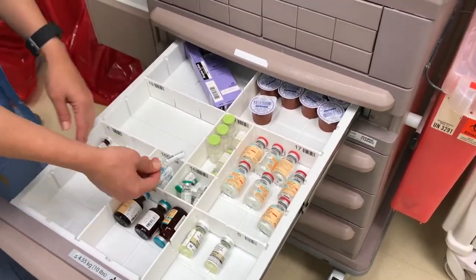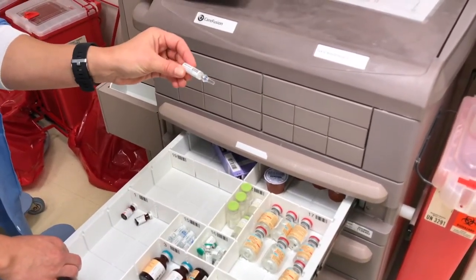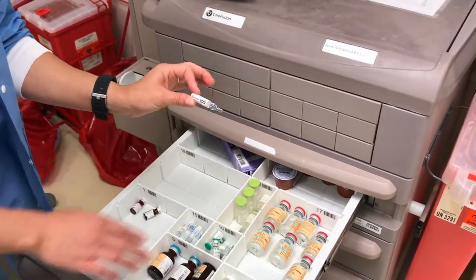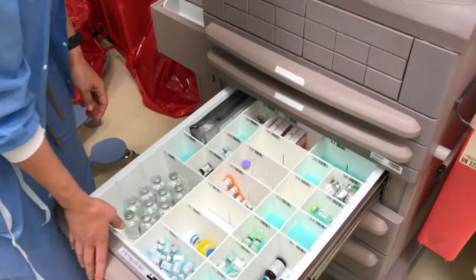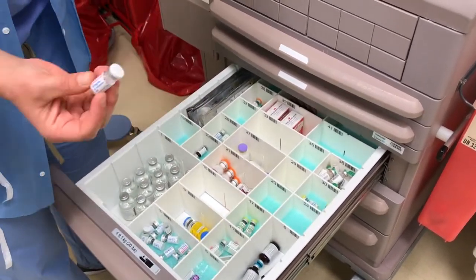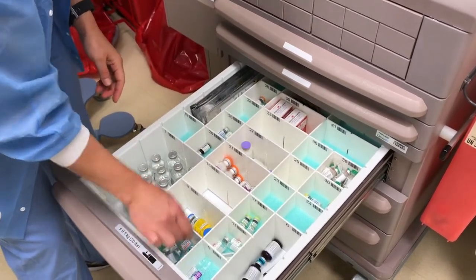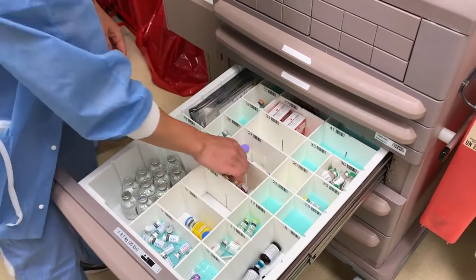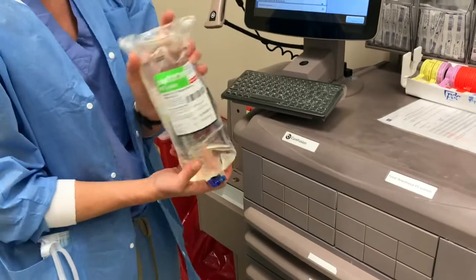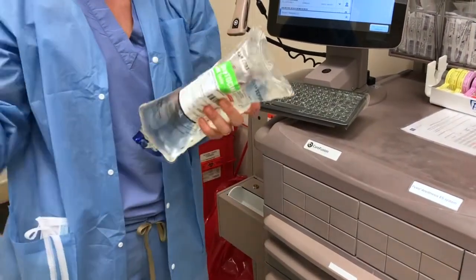And then here's our current spinal dose of bupivacaine, the 0.75%. Occasionally it may be on back order and you'll have to use a different concentration, but that's what we're using for now. And the next drawer is going to be your phenylephrine. This is currently on back order for the sticks, so you may need to draw it up in a bag as we are doing currently. Here's your Ancef, and then here's the bags of PIT. We're currently using these bags of Pitocin. Some residents like to take out one or two bags at the beginning of the case and put it in the fluid warmer.